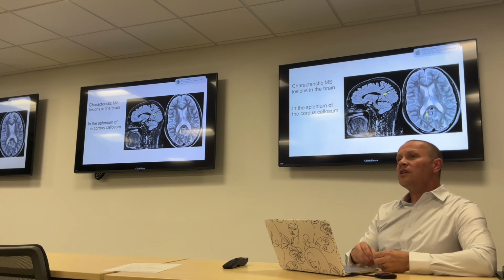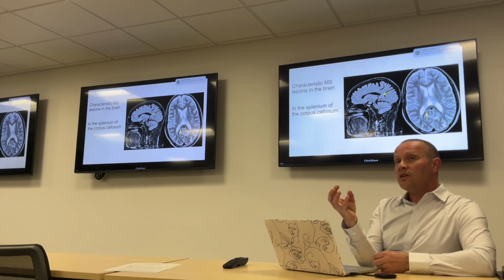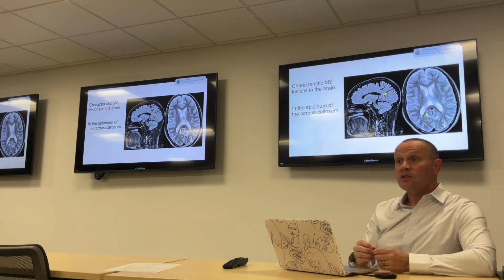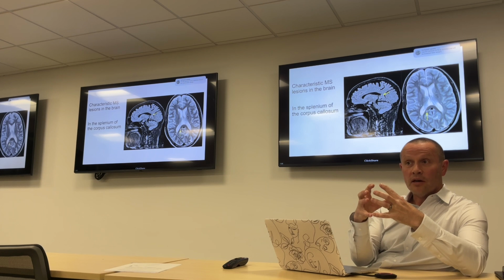Well, I think if you're seeing an MS lesion, that's not actually CSF. CSF is the fluid around your brain. An MS lesion is brain tissue that has been infiltrated by inflammation, and the inflammation includes some fluid. That's why there's brightness to it on a T2 weighted picture. And so sometimes an acute or a new or an active MS plaque will be bigger than the other plaques that have been there a long time.